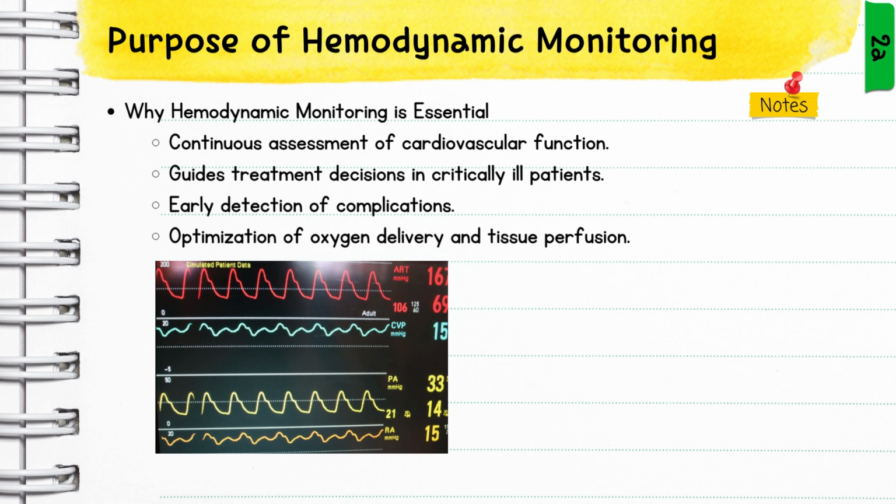Okay, so hemodynamic monitoring is one of the basics of health assessment in an advanced way. But I always want you to remember the monitor needs to correlate with what your patient looks like. We don't treat the monitor, we treat the patient. So if the monitor says something, does it match with how the patient is presenting in front of you?